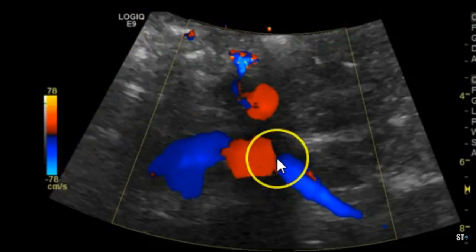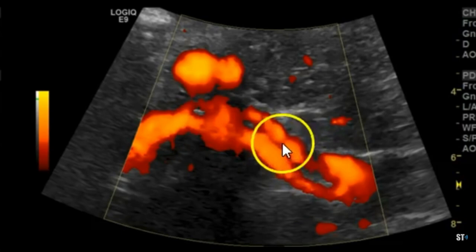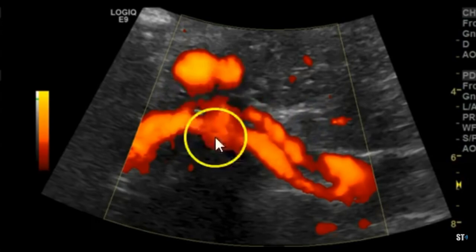If you angle the transducer, you'll be able to pick it up in red. Here is a power Doppler view of the same arteries — aorta, left renal artery, right renal artery. And then this is the left renal vein. You can see the SMA, and the left renal vein courses between the aorta and the SMA.